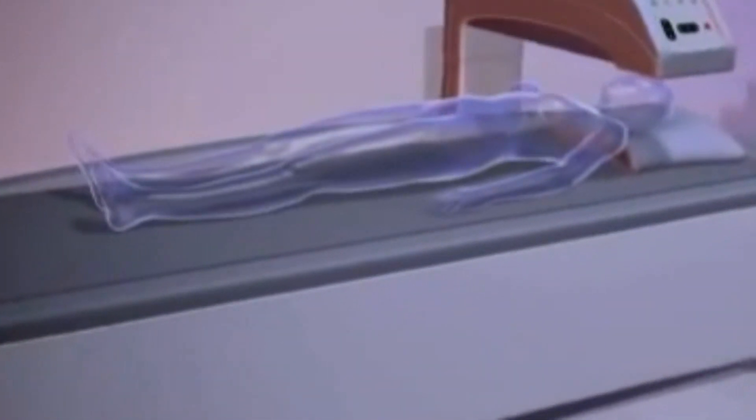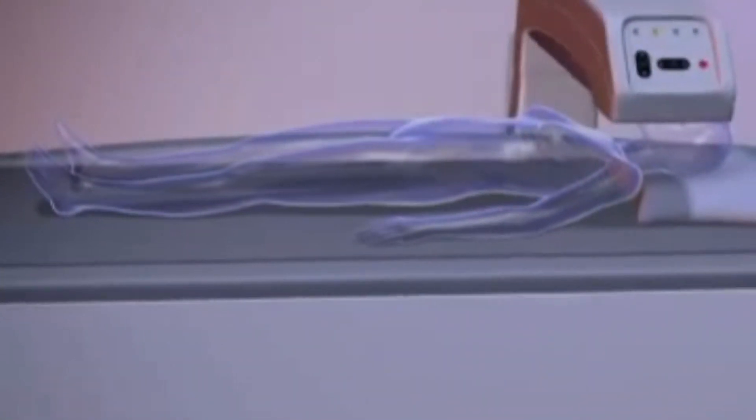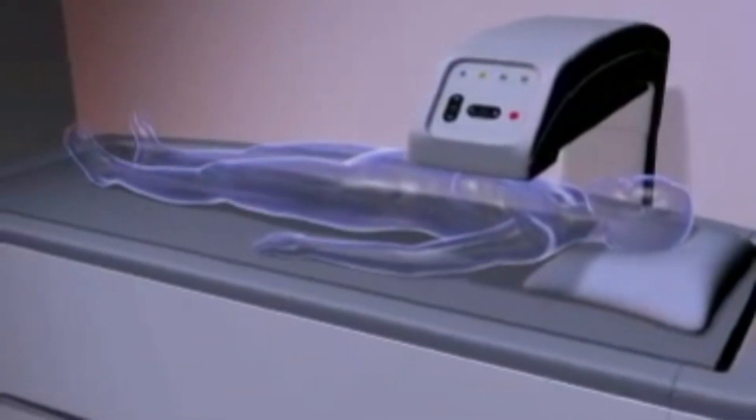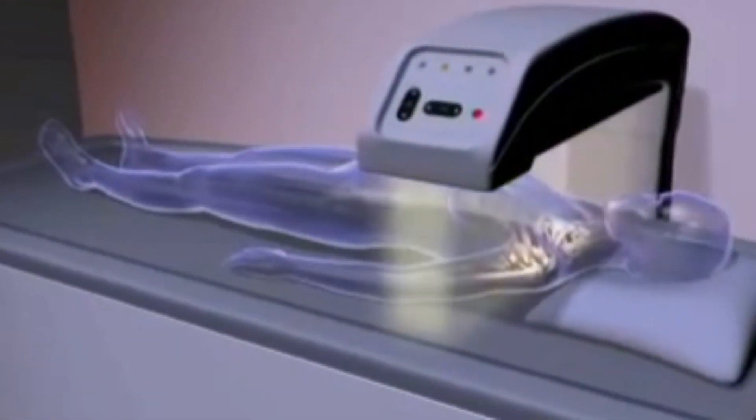What is a DXA scan? A DXA scanner is a machine that produces two x-ray beams, one is high-energy and the other is low-energy. The machine measures the amount of x-rays that pass through the bone from each beam. This will vary depending on how thick the bone is. Based on the difference between the two beams, your doctor can measure your bone density.